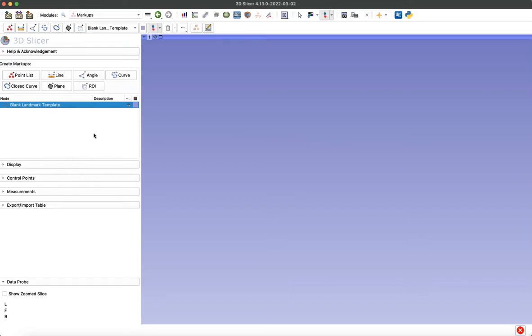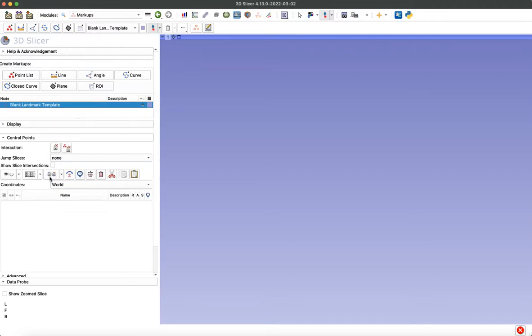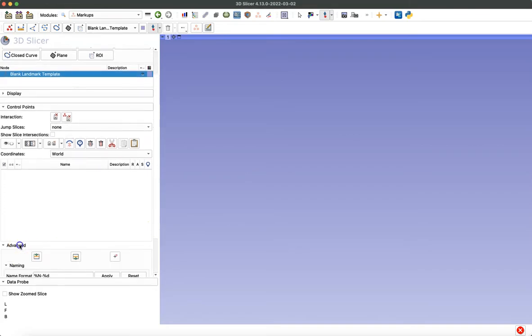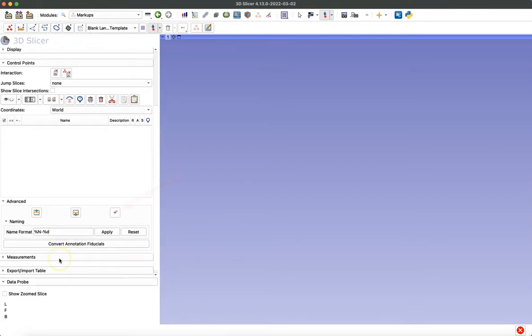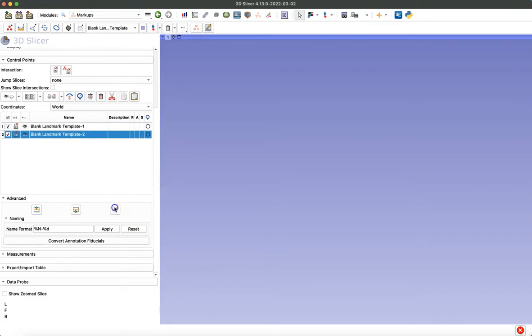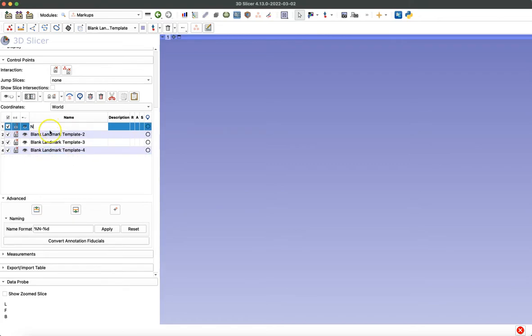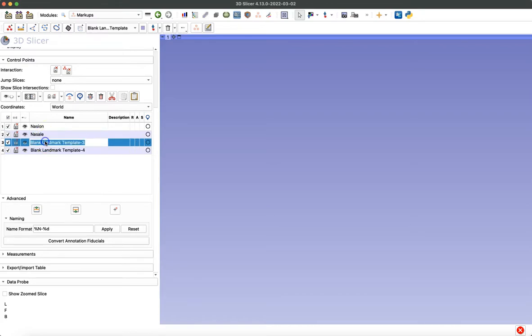You can also use this description area on the right if you'd like. You could add the date you started the project or the lab that the project is for. Then we'll expand this control points menu and the advanced menu as well. Here we can add empty landmarks that we'll be able to attach coordinates to later. I'm going to add a couple of points to use as an example. You can rename them by double-clicking on those titles. I'll use nasion, nasale, basion, and opisthion.